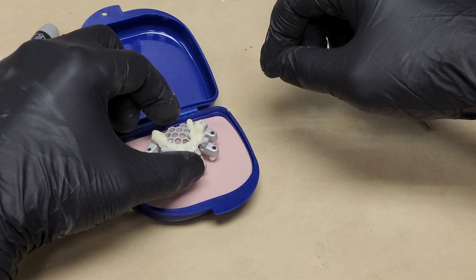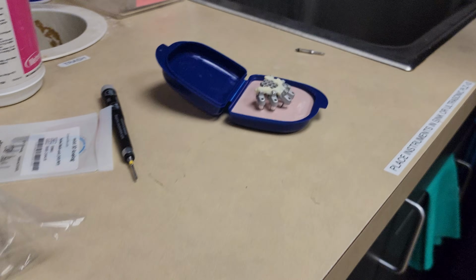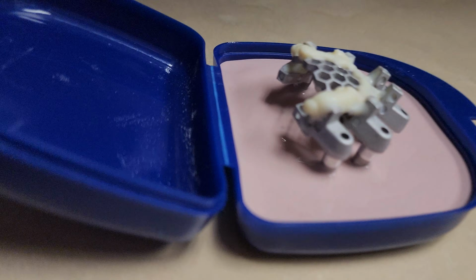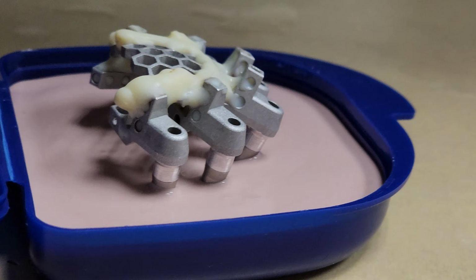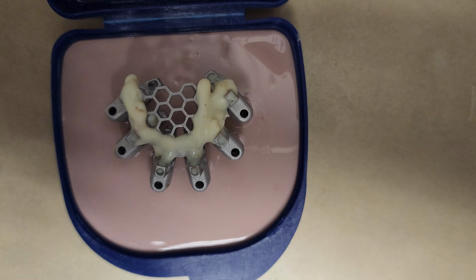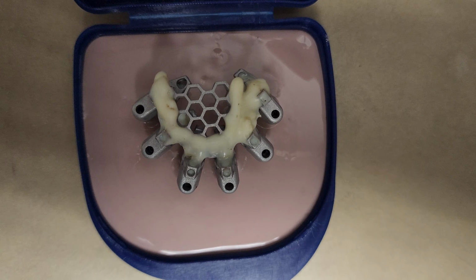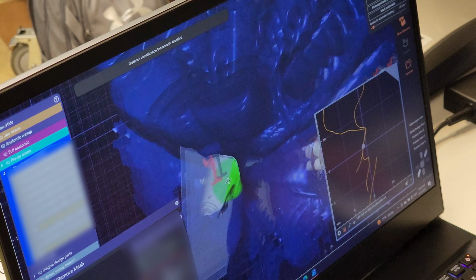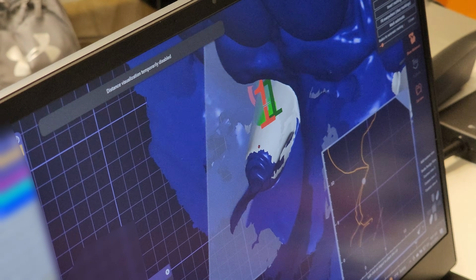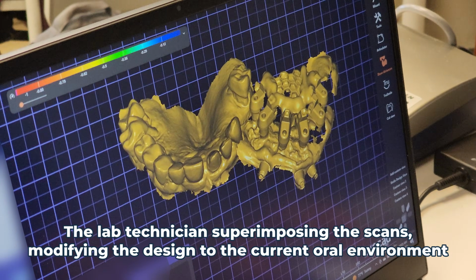Now, one of the reasons why this process I use is better than what other dentists do is you have this jig from the time of the surgery and on should anything happen. For example, if the provisional prosthesis that we're making breaks, you can make a new prosthesis that day without the patient even there or even coming into your office. Ironically, I rarely have temporary implant dentures break like other dentists more commonly do. So I hardly need this option available, but if I do, I can do all of this without the patient even around.